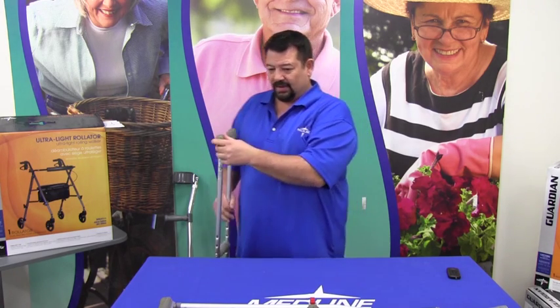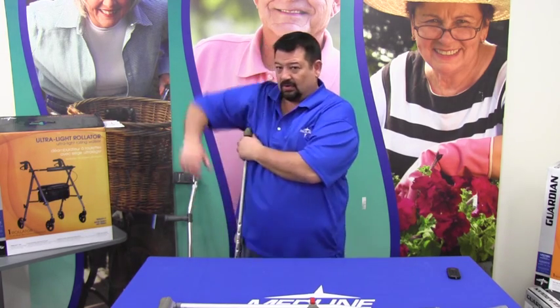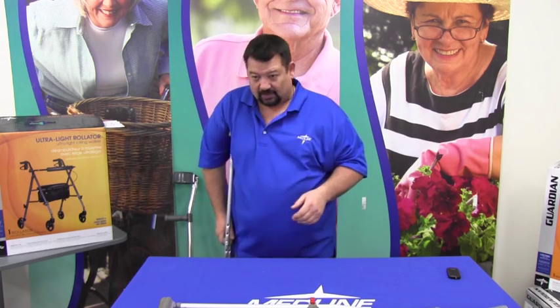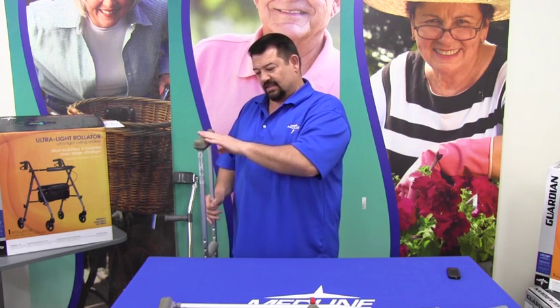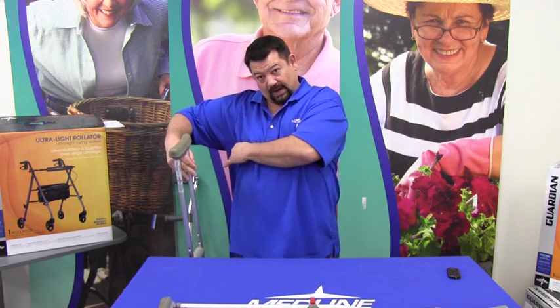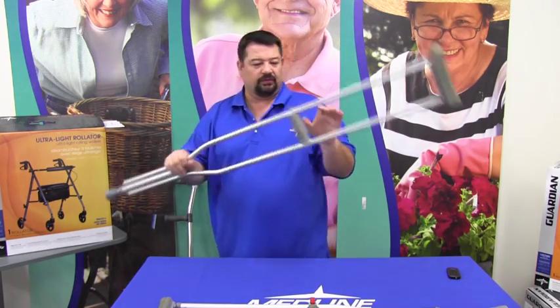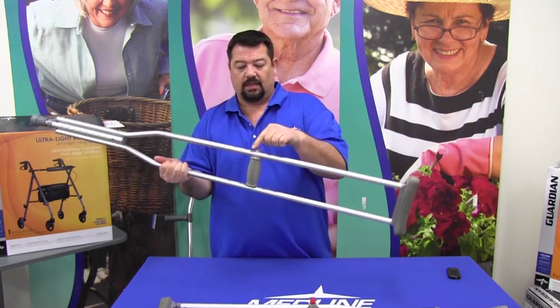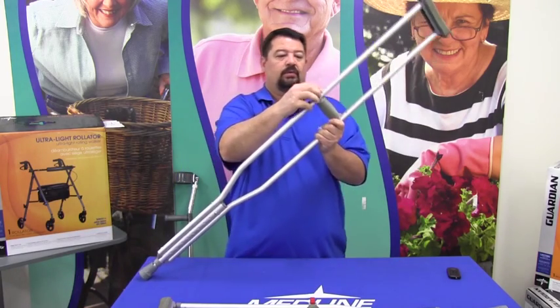What we want to make sure is that we get that proper fit from the ground to the axilla. And in this particular case, this crutch is just a little too tall for me. But the idea is that this pad resides right at that axilla point. Now, with this style of crutch, again, the push buttons will be here. This uses a wing nut that you simply unscrew.